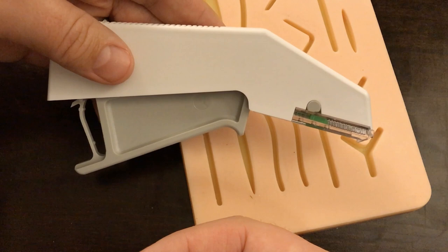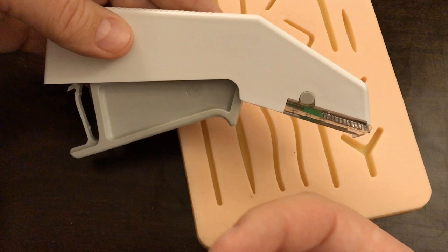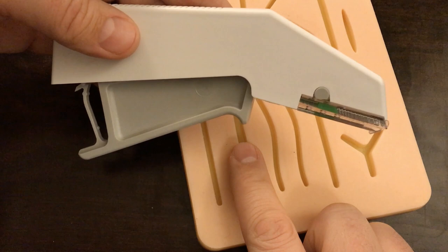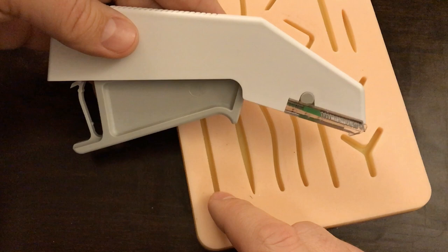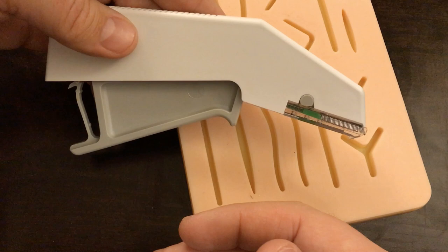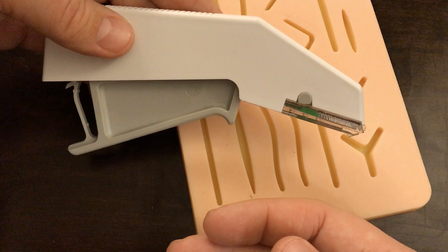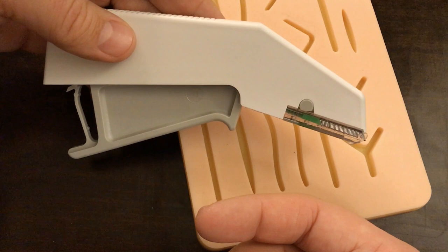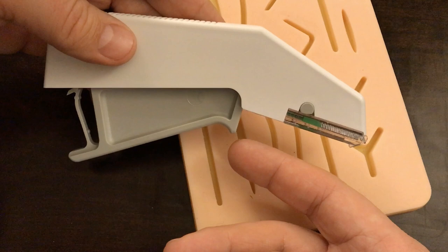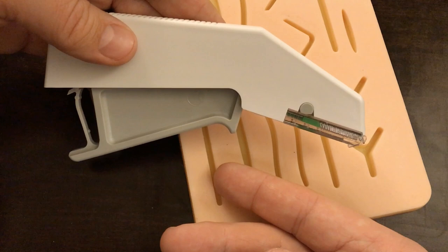Something to remember with a stapler is that it is going to cause more of a scar. So if there's any cosmetic reason to minimize scar formation, staples are probably not your best bet. It wouldn't be wise to use staples on a visible part of the body like the face, neck, hands, or arms — sutures would be preferred. Stapling is very common in some operating rooms; in neurosurgery we would occasionally use a stapler along the lumbar spine, and it's also common for scalp lacerations or surgical incisions on the scalp.